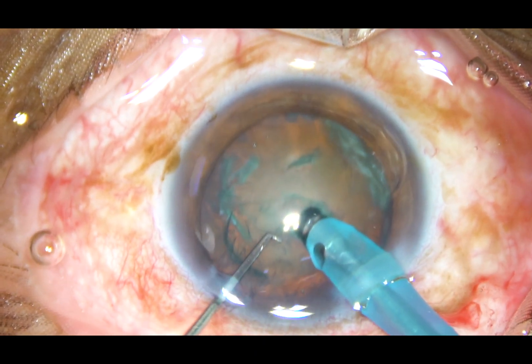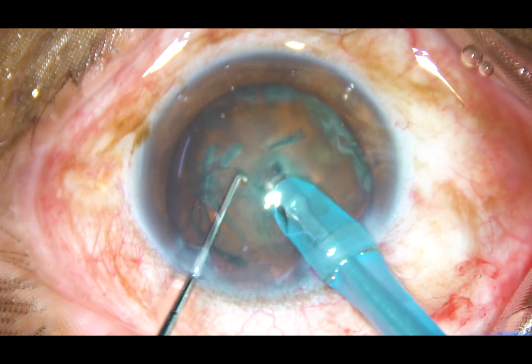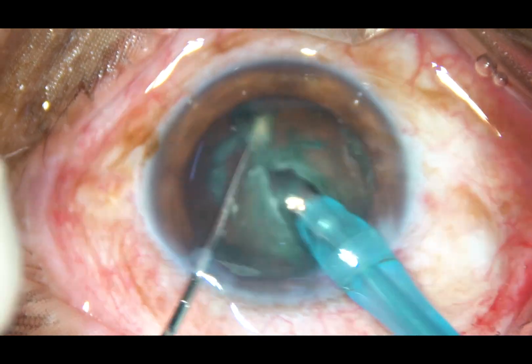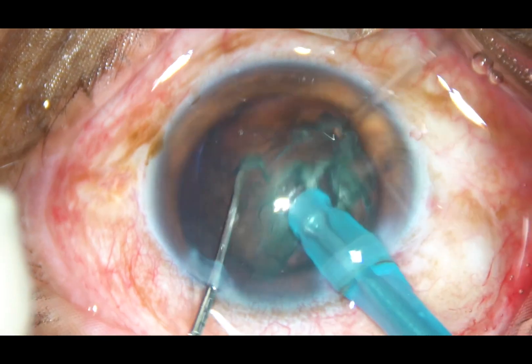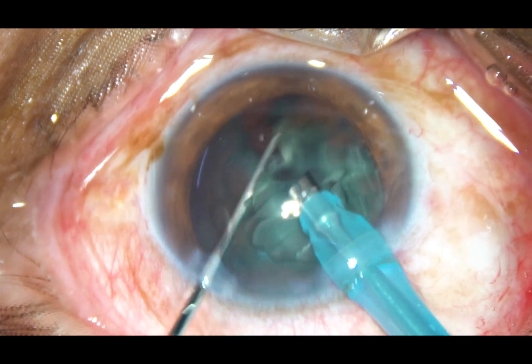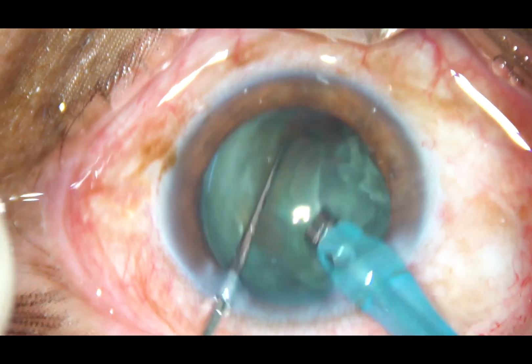After 2-3 sculpts, bury the tip into the substance of the nucleus, hold the nucleus firmly and chop it. Rotate the nucleus, hold it again and chop at another place. This free nuclear fragment can be emulsified now or later.